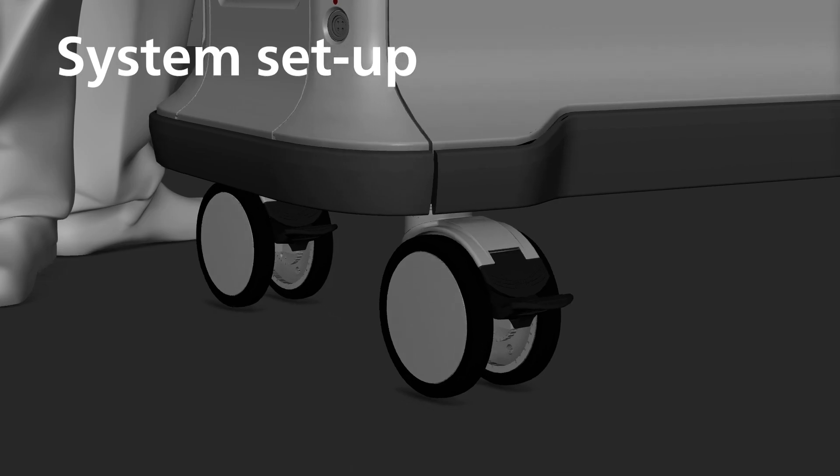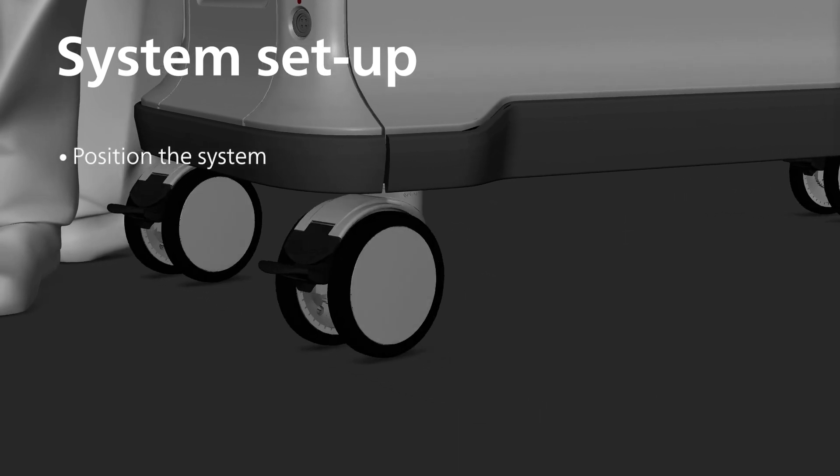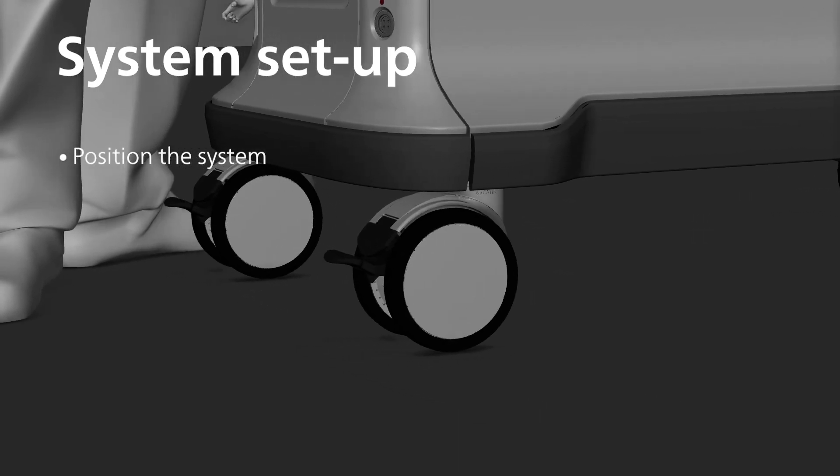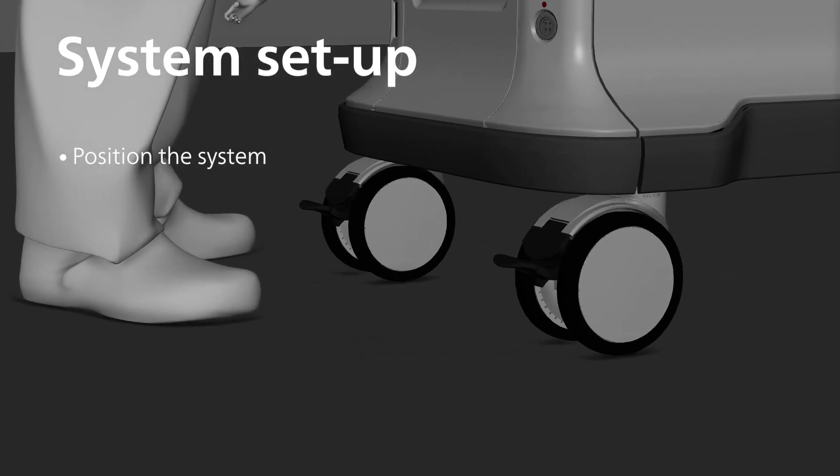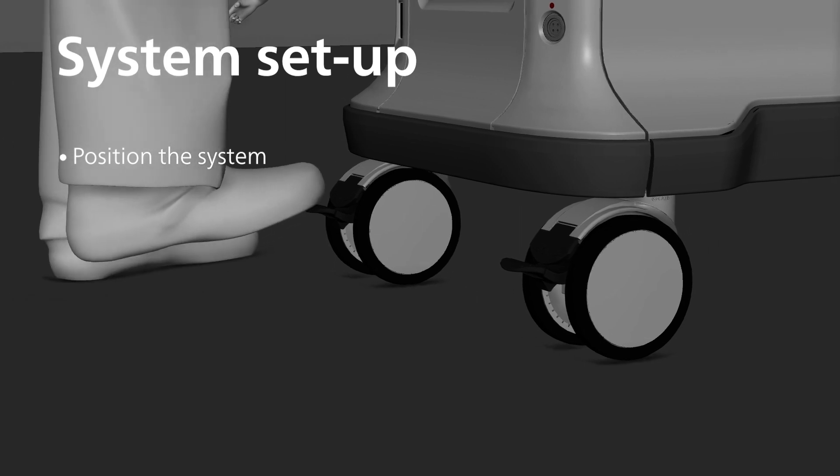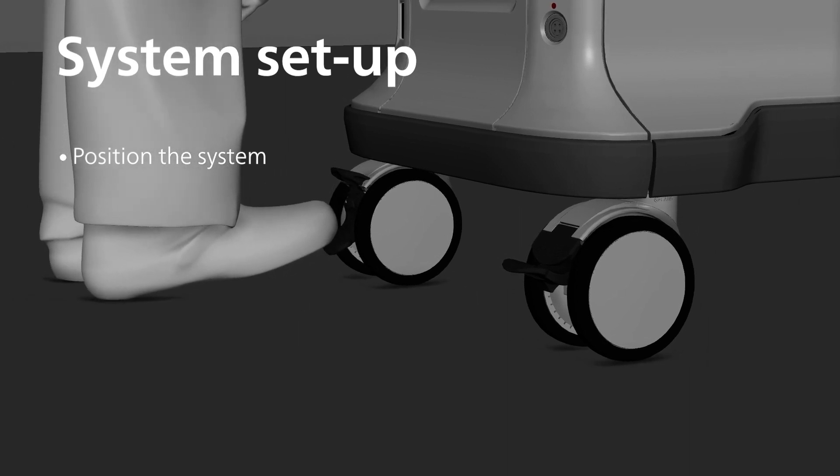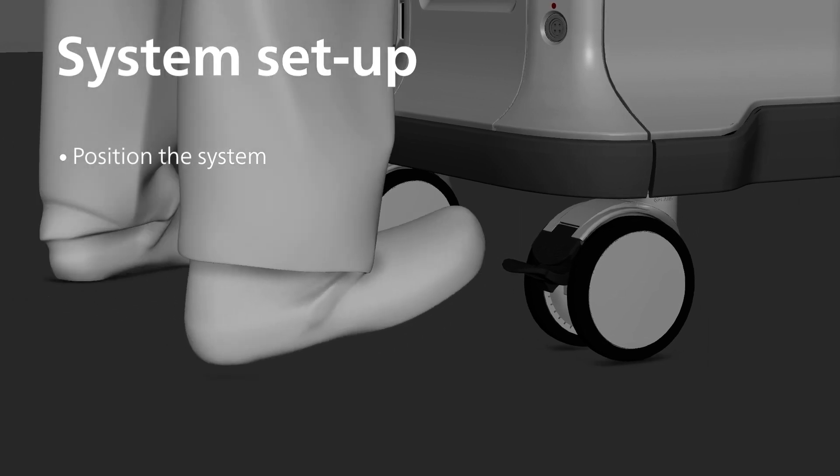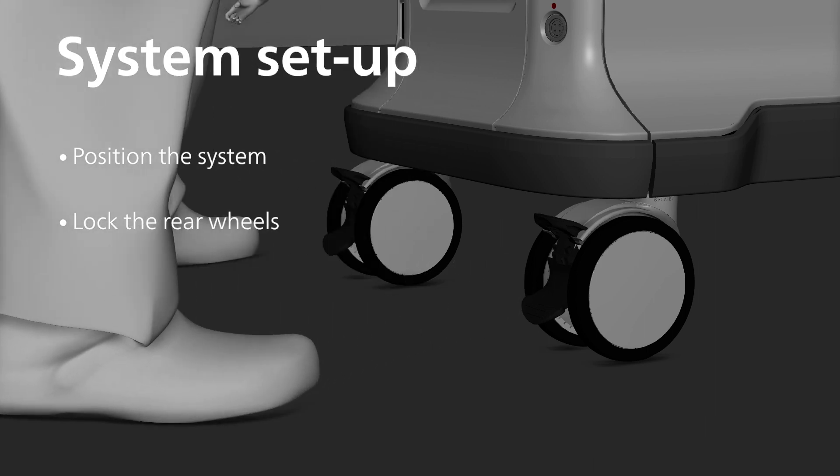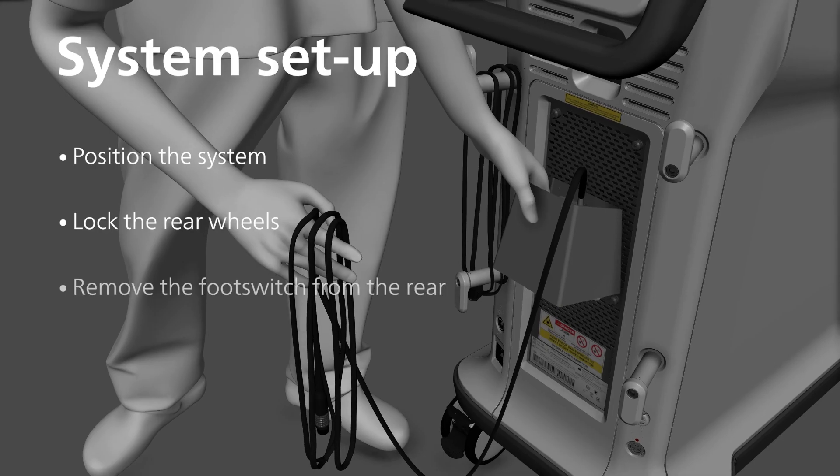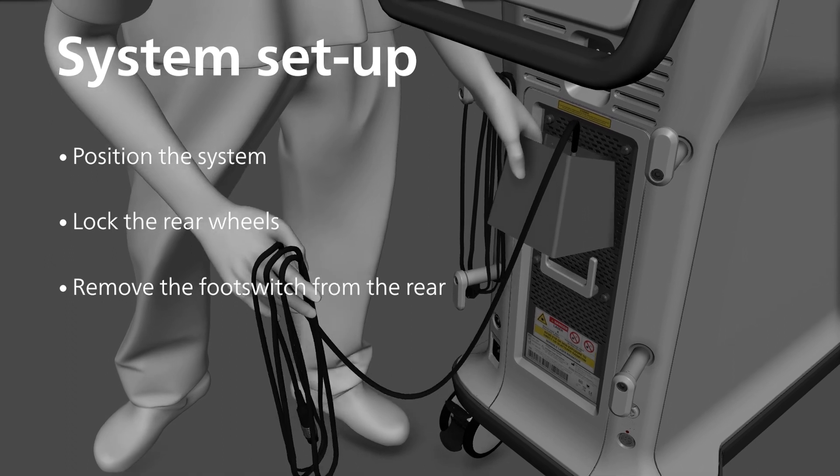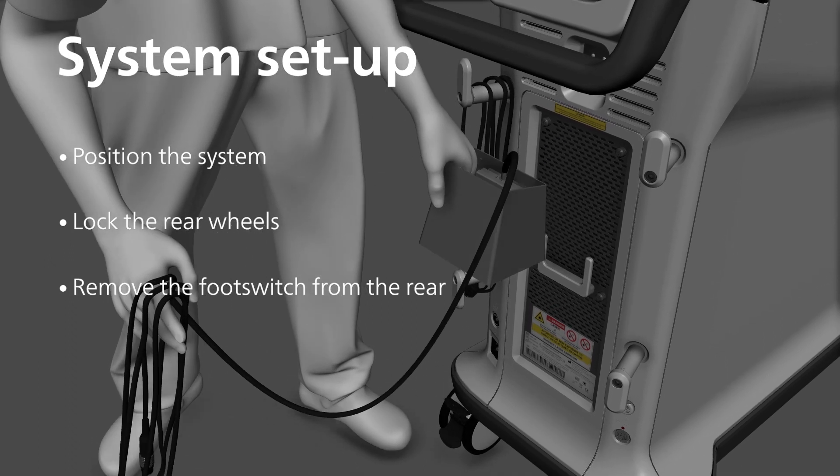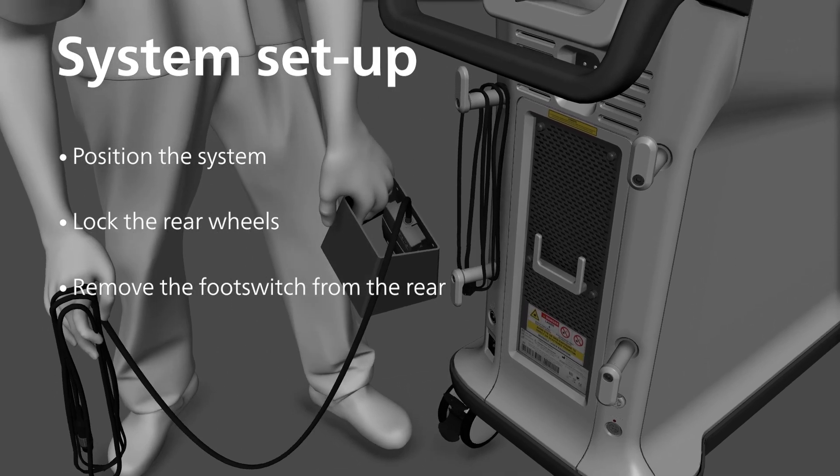To set up, first position the system in the desired location. The front wheels can be unlocked to allow lateral movement for final positioning. Rear wheels should be locked to avoid any movement of the unit once in position. Remove the footswitch and its lead from the storage location at the rear of the system.